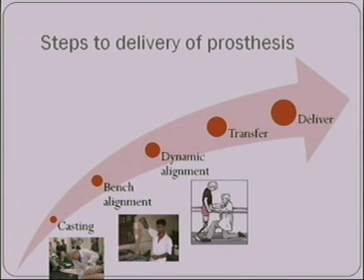So they're dynamically aligning this. The patient is giving input to the practitioner, and the practitioner is asking questions of the patient. And within maybe a half hour to an hour, they're going to come up with a really nice custom alignment that works really well for the patient. And that new dynamic alignment is way better than the old bench alignment. So the old bench alignment is no longer necessary, and you'd never want to go back to your old bench alignment at this point.